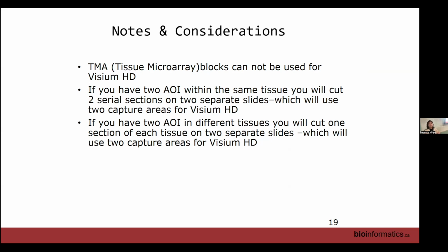I would guarantee you that out of that list I mentioned to you, 3 of them are going to lift. And if you have that all for Visium, you're going to lose all that data because it lifted, and all you have left is like one piece of tissue. So do you proceed with Visium HD or do you not? These are things you're going to come into problems with. So I highly suggest just don't do the tissue microarray arrangement. Xenium, possible, but Visium HD, I would not do it.